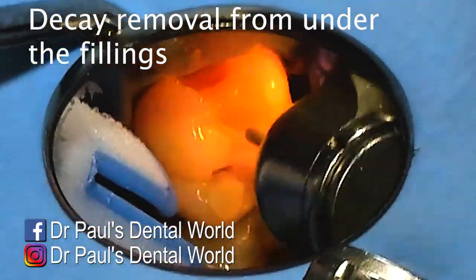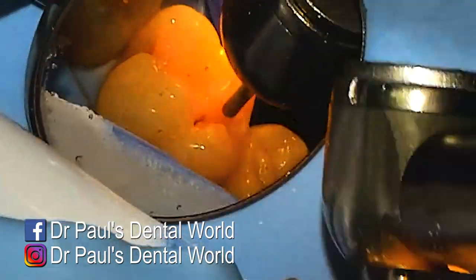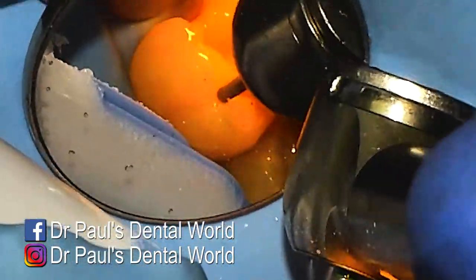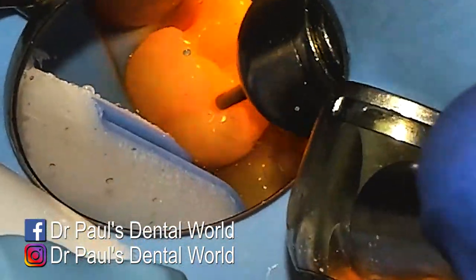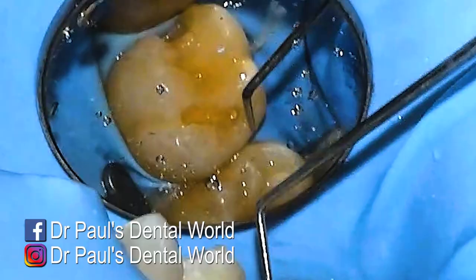Now we go back to the top portion of the tooth and I'm just addressing the areas where the decay is. I'll go out with my high speed first and then after I've cleaned it out with my high speed, I'll then switch over to my slow speed burr, just feeling around making sure it's all clear.